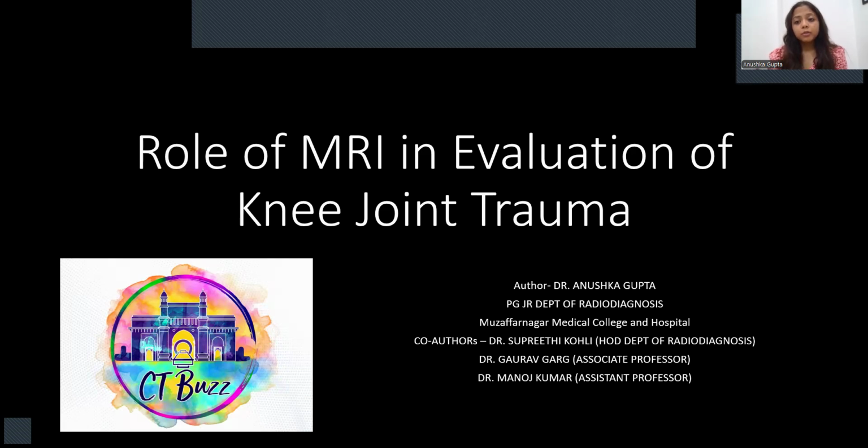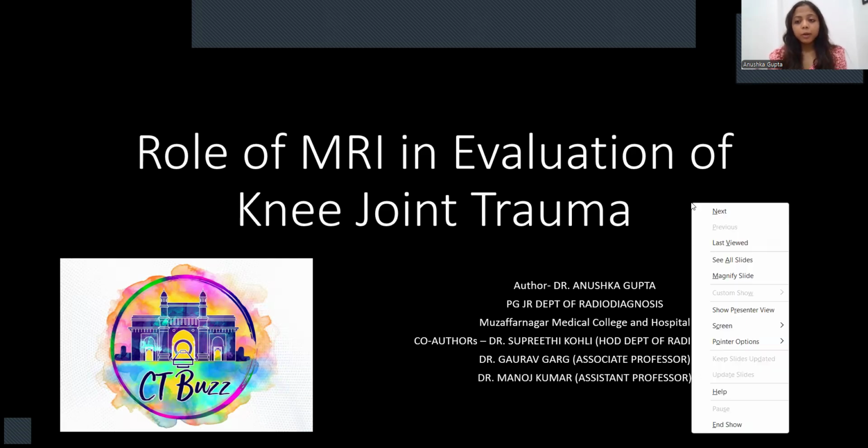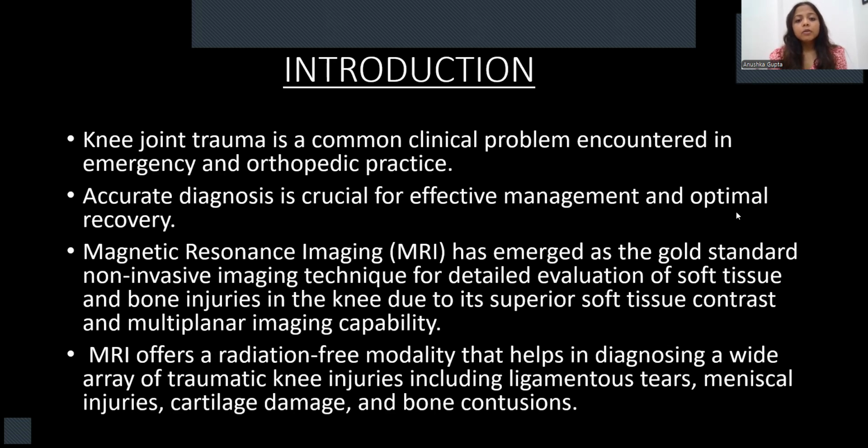And my topic for today's paper presentation is the role of MRI in evaluation of knee joint trauma. Knee joint trauma is a common clinical problem encountered in emergency and orthopedic practice. Accurate diagnosis is crucial for effective management and optimal recovery.